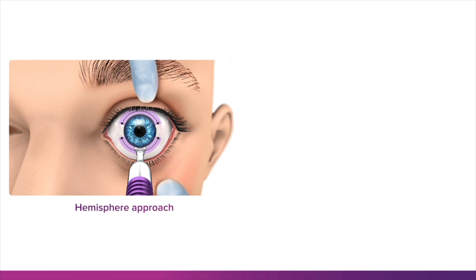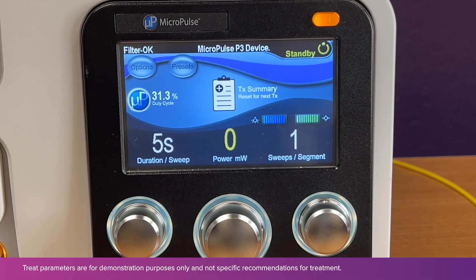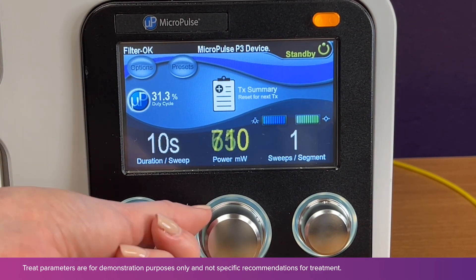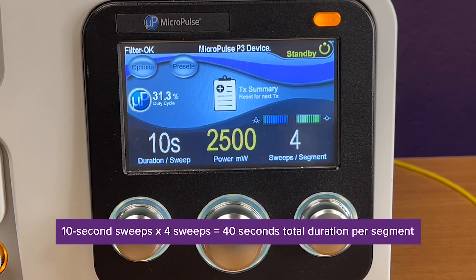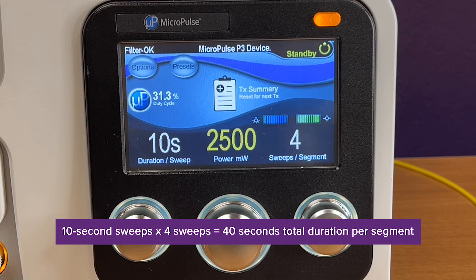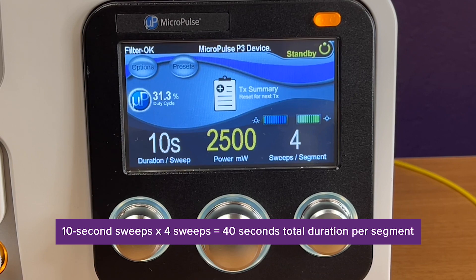A segment can be defined as either a hemisphere or a quadrant based on the physician's preferred delivery method. In this example, a segment is defined as a quadrant. For demonstration, let's program a 10-second sweep, 2,500 milliwatts of power, and 4 sweeps per segment. The software multiplies the duration per sweep setting and the sweeps per segment setting to calculate the total duration per segment, which is displayed in the treat screen. In this example, the total duration will be 40 seconds.